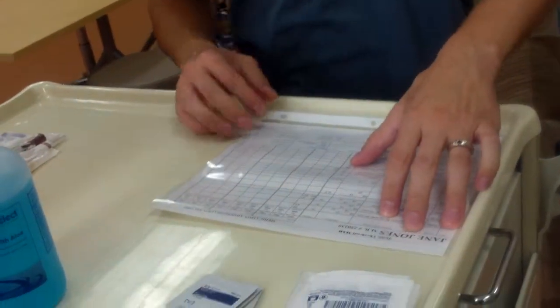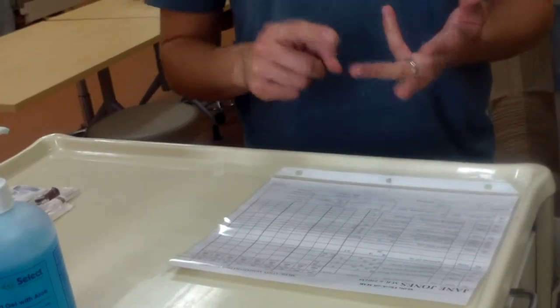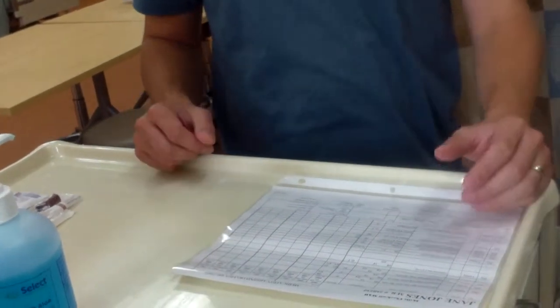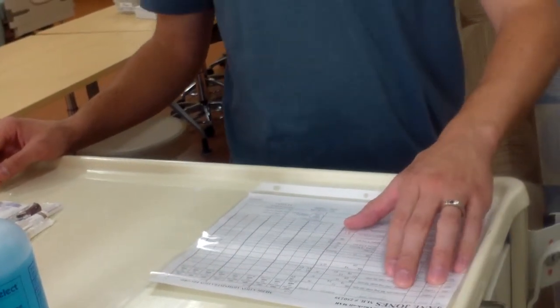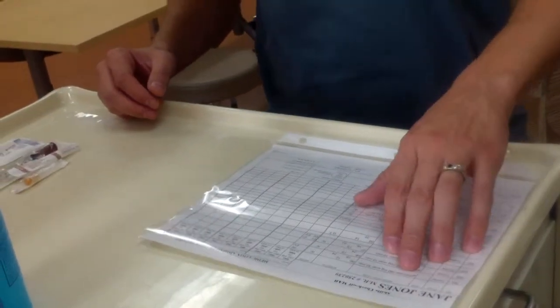I know I have the right patient. And it's important to know for each medication that you withdraw the allergies, the effects of the medication, the adverse effects of the medication, the purpose of the medication, and if there's any special nursing assessments that I need to make for the medication before I administer it. So the first one I'm going to do is check that I know I have the right patient. The patient's there in his room because it's the right time. I check that first, and then I check the medication as I'm withdrawing it.